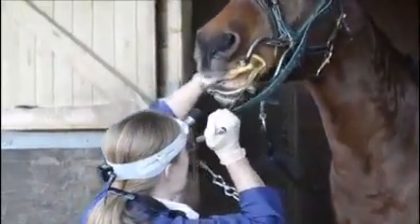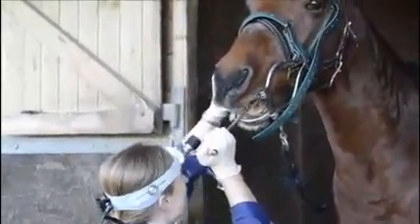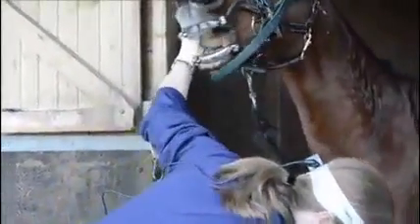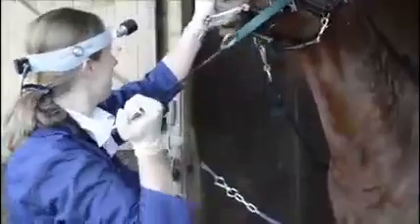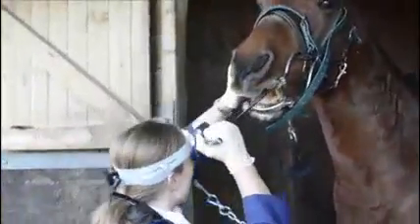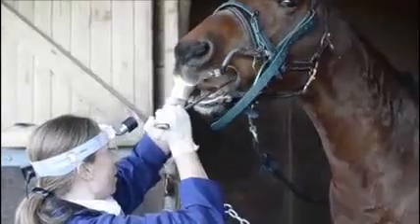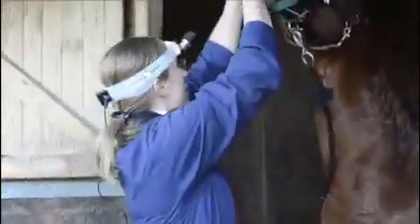Let's see if you grab your tongue, my friend. Good boy. Steamed up a little bit, so just have to warm it up. It's a cold day here. He has a lovely warm mouth. Just there. You can see it. Thank you.